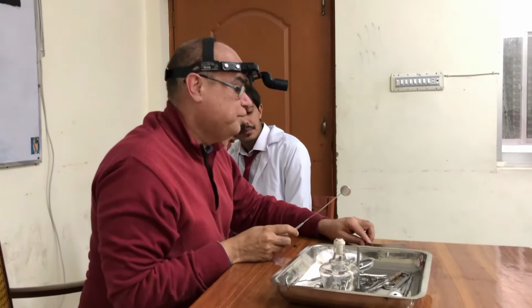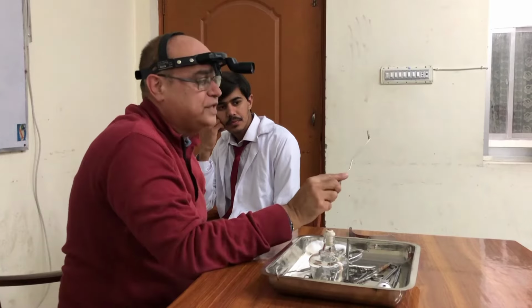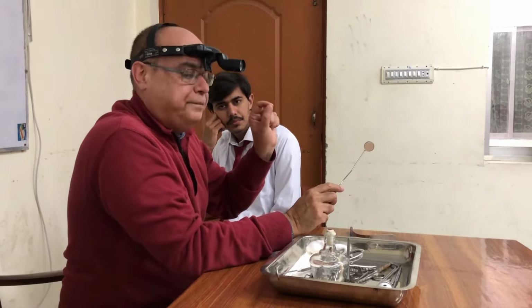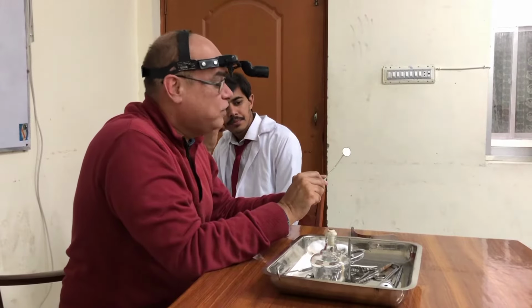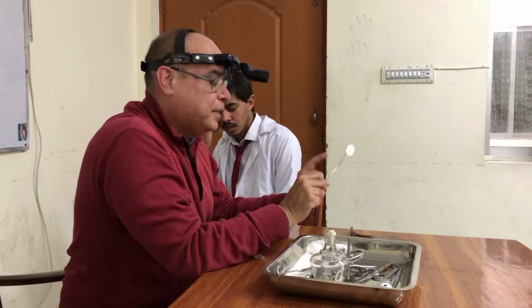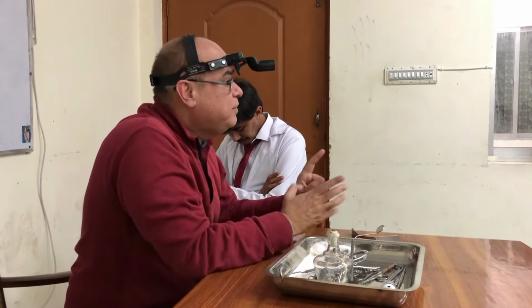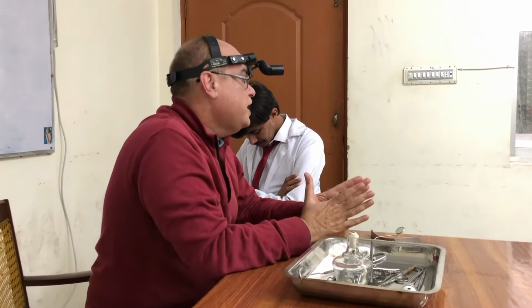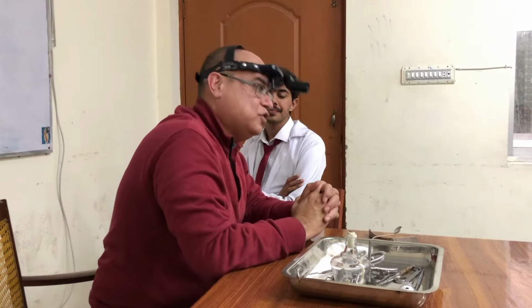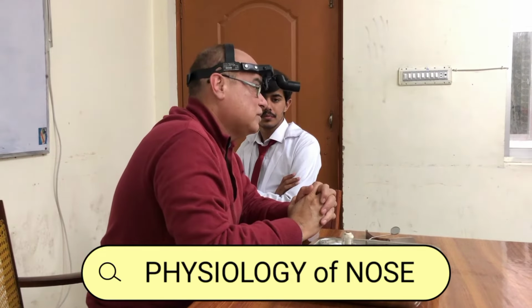And as I told you, this is one of the most difficult and you have to do it quickly. So the key for posterior rhinoscopy is this posterior rhinoscopy mirror with a stem, then a metallic tongue depressor you have to use, and your patient will be breathing through the nose during the procedure. Once we have done this posterior rhinoscopy, then we will go for physiology of the nose.